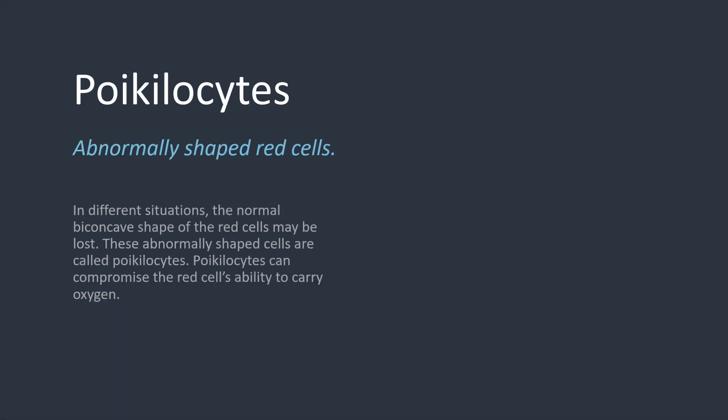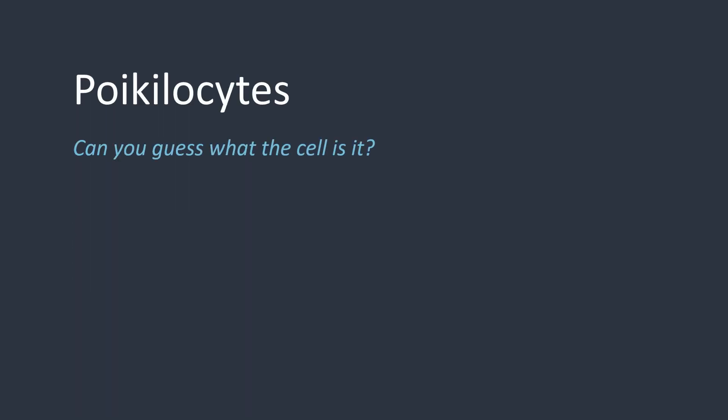When red cells lose their biconcave shape due to pathological conditions or artifactual in-vitro phenomena, they are described as poikilocytes. Poikilocytes can come in a whole range of different shapes. We'll go into more detail about them in a different video. You'll have a short while to guess what each one is before the answer is displayed — if there are any which aren't shown in the images, feel free to mention that in the comments below.